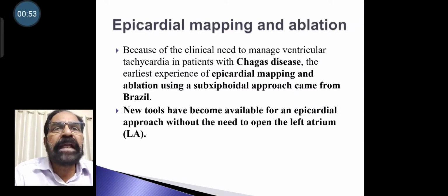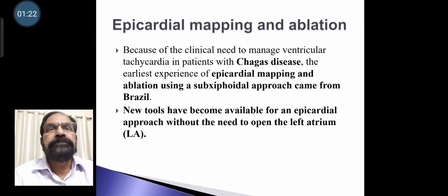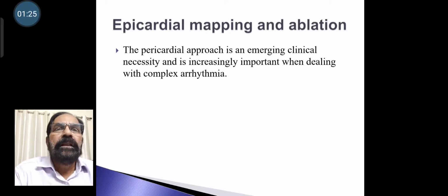Because of the clinical need to manage ventricular tachycardia in patients with Chagas disease, the earliest experience of epicardial mapping and ablation using subxiphoid approach came from Brazil. New tools have become available for epicardial approach without the need to open left atrium. The pericardial approach is an emerging clinical necessity and is increasingly important when dealing with complex arrhythmia.